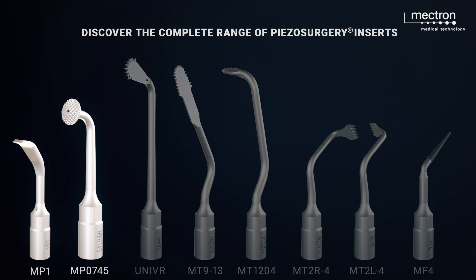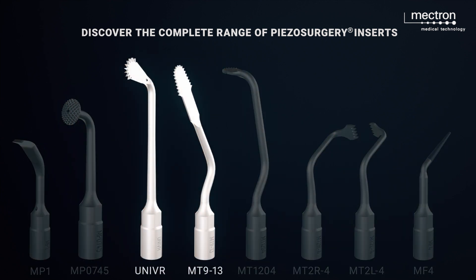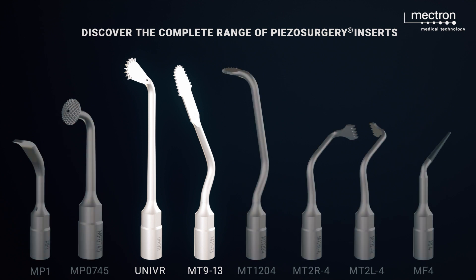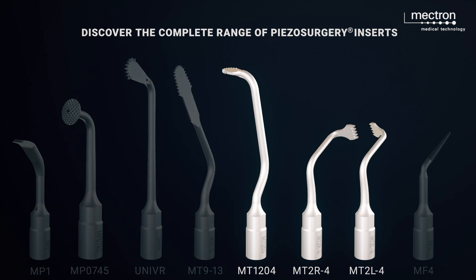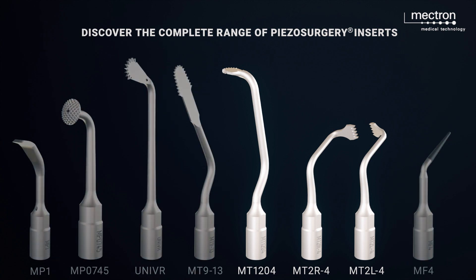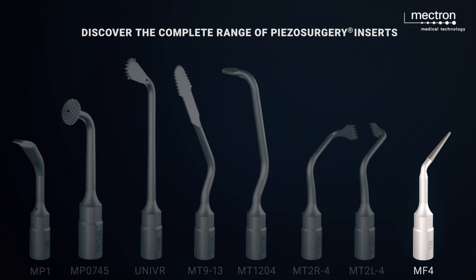MP1 and MP0745 are suitable for the superficial removal of bone. For osteotomies, especially universal and MT913. For lateral and transverse osteotomies, MT1204 or MT2R4 and MT2L4. MF4 is the insert for drilling holes.